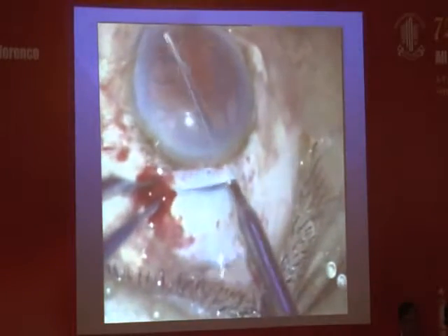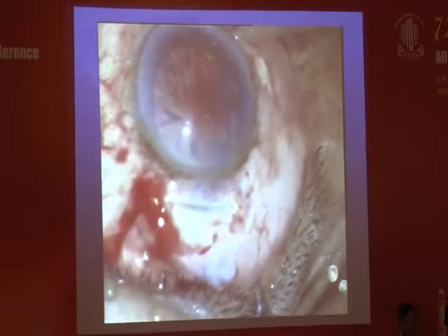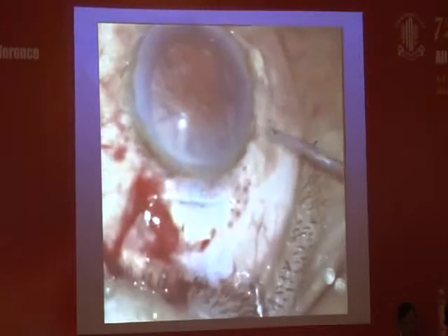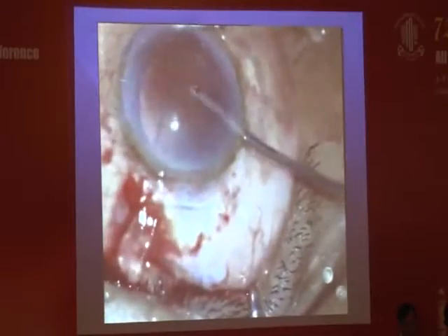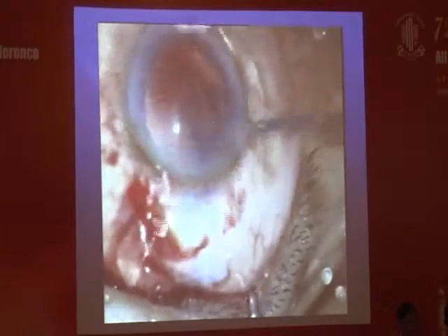This is the flap of the anterior capsule, and here I have made the mistake because I have cut that. Now you can see the crumpled capsule. Crumpled capsule means there is a PC tear, and I have not seen that PCR now. It is because of the capsule. And I am removing everything.